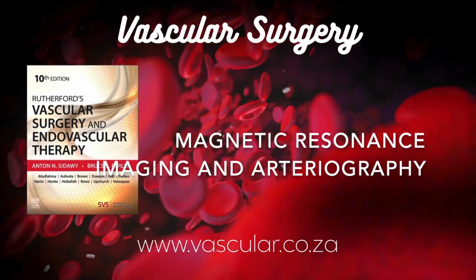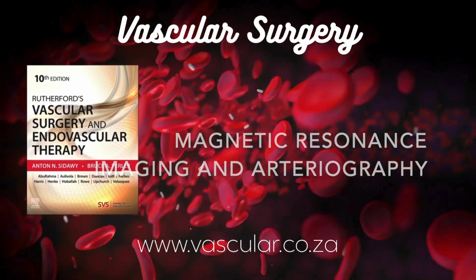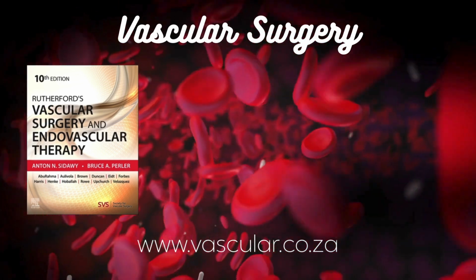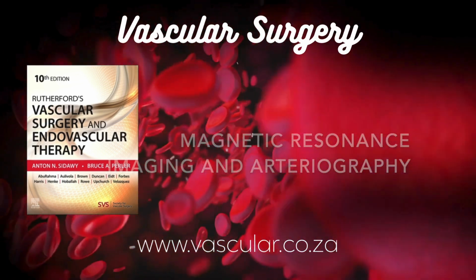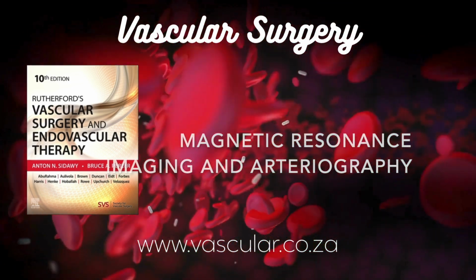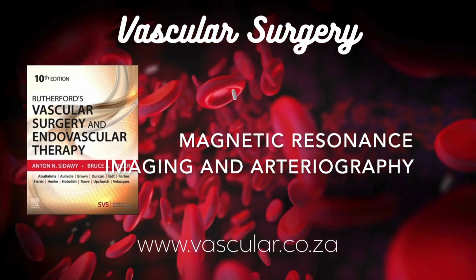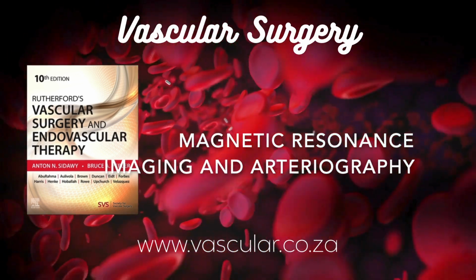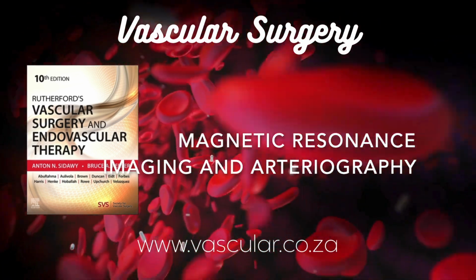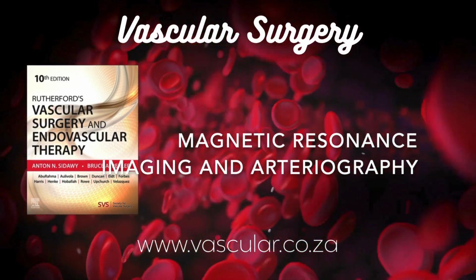Okay, so we've got aligned protons thanks to the big magnet. What's the role of those magnetic field gradients you mentioned? The gradients are crucial. They create small, very precisely controlled variations in the magnetic field strength across the area we're imaging. And why do that? Because it allows the MRI system to figure out where the signals are coming from. It's called spatial encoding. Essentially, the gradients make protons in different locations resonate at slightly different frequencies, telling the machine the signal's origin point. I see. And the rapid switching on and off of these gradients is actually what produces those characteristic loud knocking or banging sounds you hear during an MRI scan. Okay, that explains the noise.